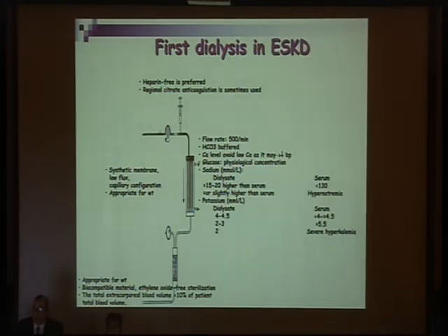Of course, it's a little bit shorter in duration. Maybe the first session is only 1 hour, and I progressively increase the duration with the following sessions, like 2 hours, until, throughout 3 or 4 sessions, I can be using the optimum parameters.